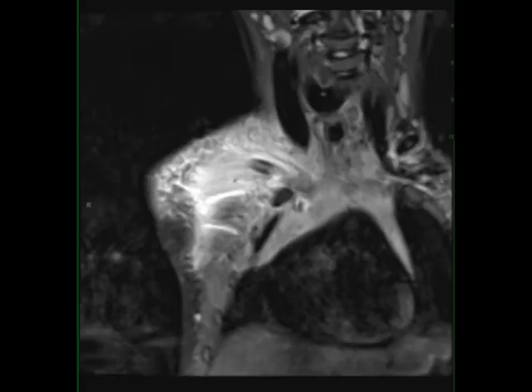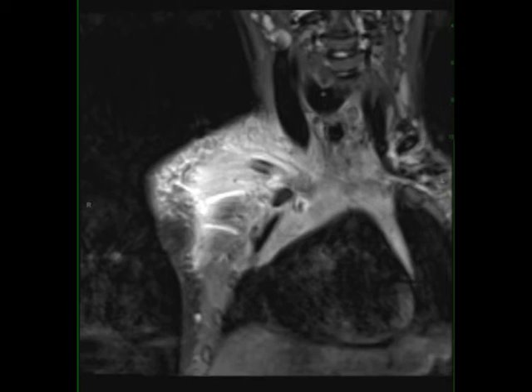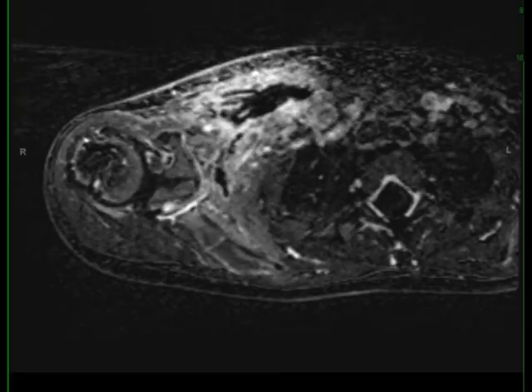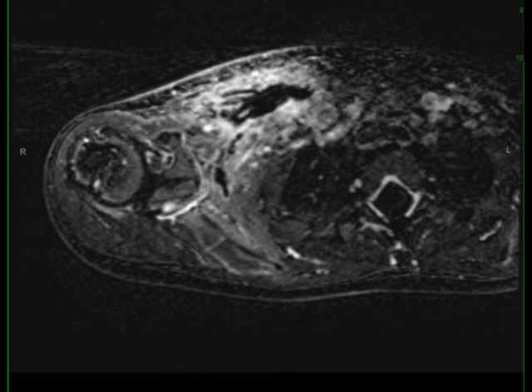These images demonstrate a large region of T1 iso-intense signal in the skeletal muscle within the soft tissue surrounding the right clavicle, extending into the supraclavicular fossa and base of the neck on the right. There is a replacement of normal marrow fat signal with a large confluent region of STIR hyperintense signal in the clavicle medullary space and surrounding soft tissues.